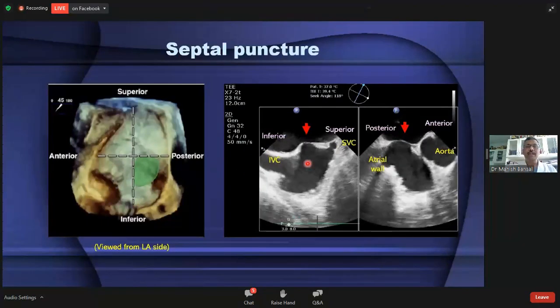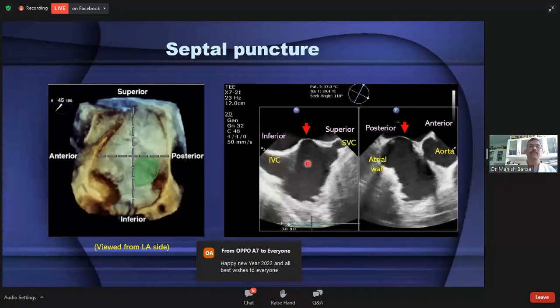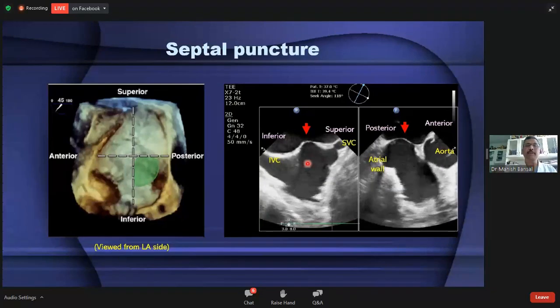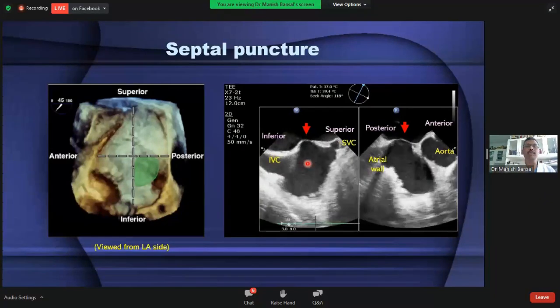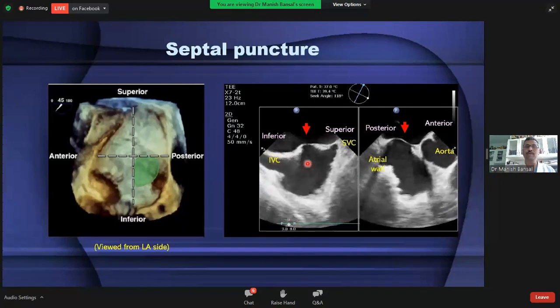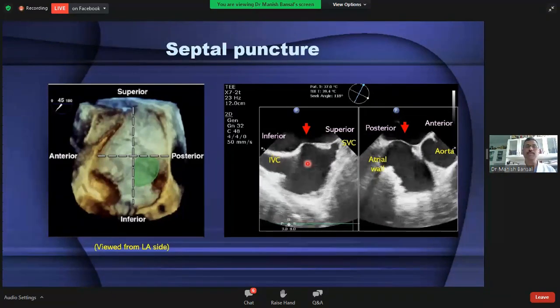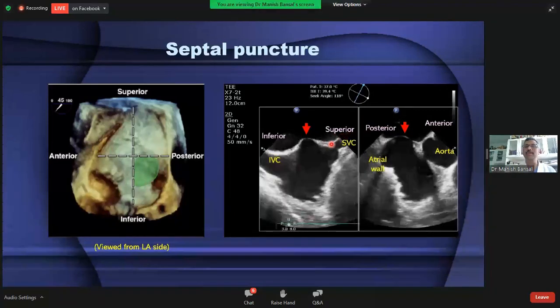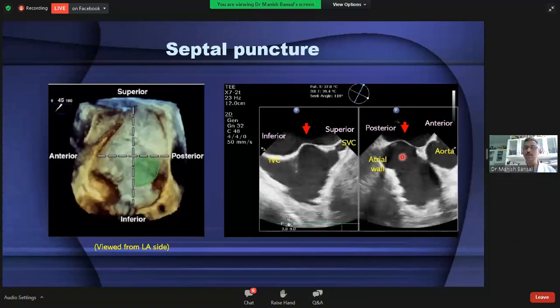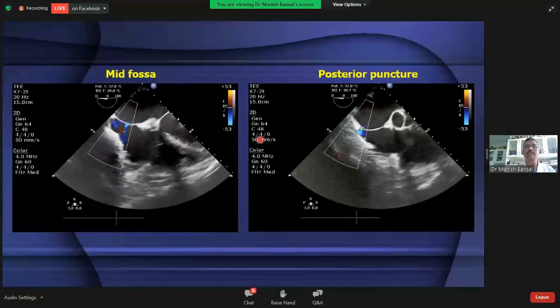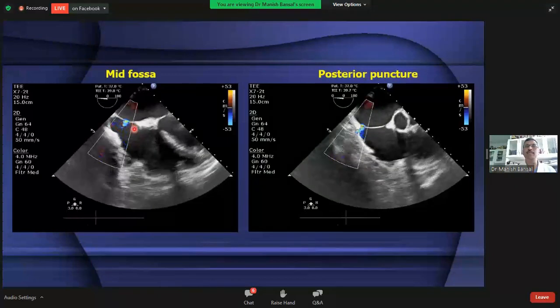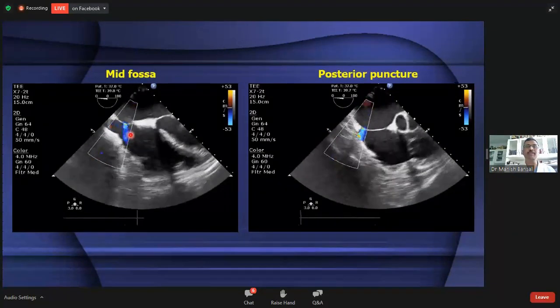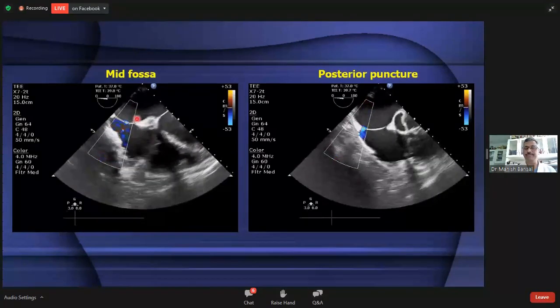Once the decision to close the paravalvular leak is made, the procedure for the mitral valve is done via venous access, requiring crossing of the interatrial septum. Precise location of septal puncture is very important — not only for this procedure but for almost all procedures related to the mitral valve and for left atrial appendage occlusion. If the septal puncture is not done in the proper position, it can cause significant problems during the subsequent procedure. For this, 3D TEE biplane imaging using bicaval imaging and short-axis view simultaneously is very helpful.